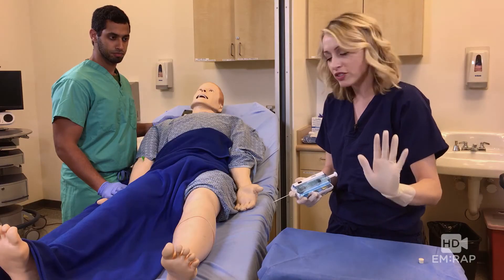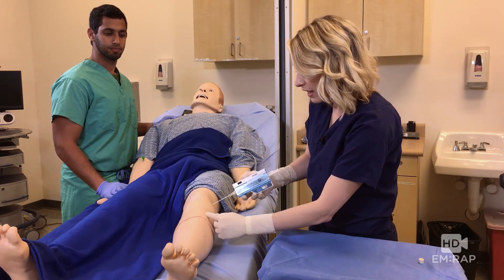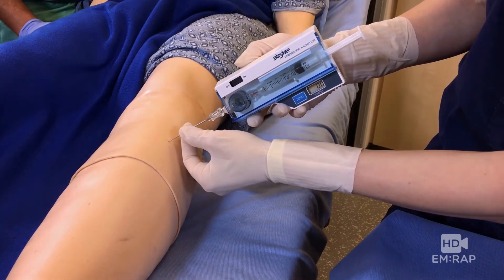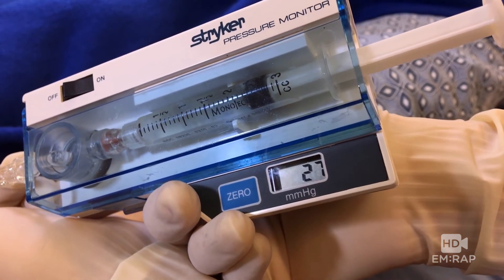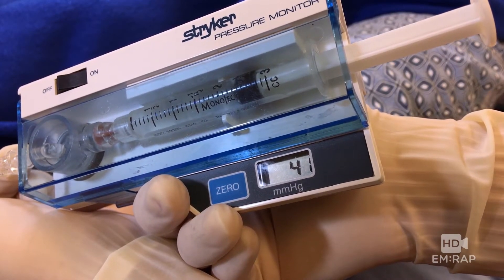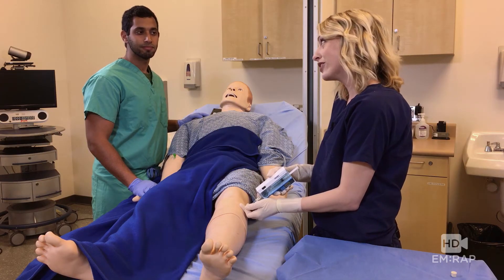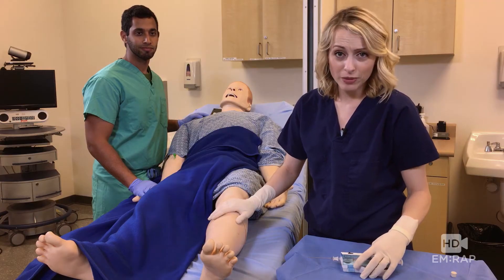Put on a fresh sterile glove, repalpate your landmarks, and go ahead and insert it into the compartment. You might feel a pop as you go through the fascia. Inject about 0.3 ml of saline, and now it should read your compartment pressure. You know you're in the right place because if you squeeze that compartment, you'll get a rise in the pressure. The pressure is over 30, so this is consistent with compartment syndrome and he's going to need a fasciotomy.